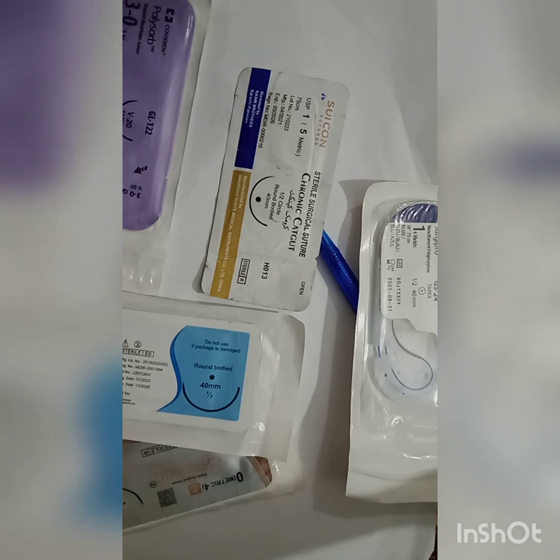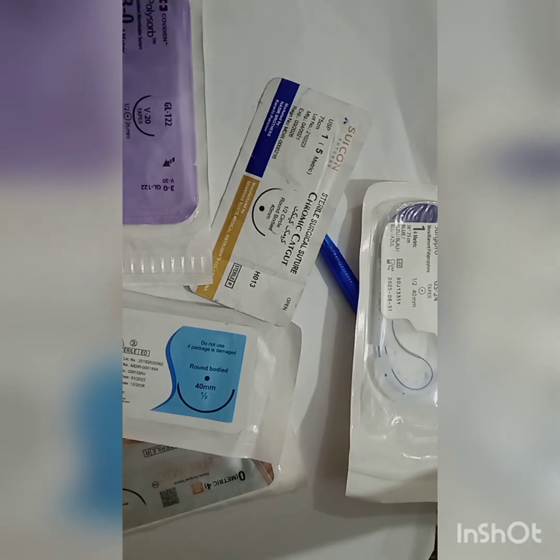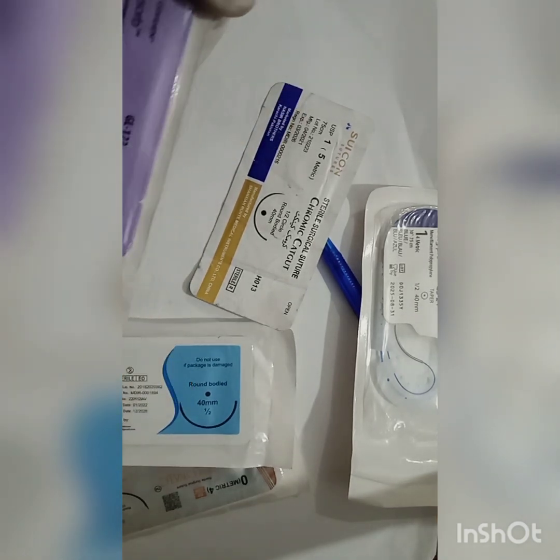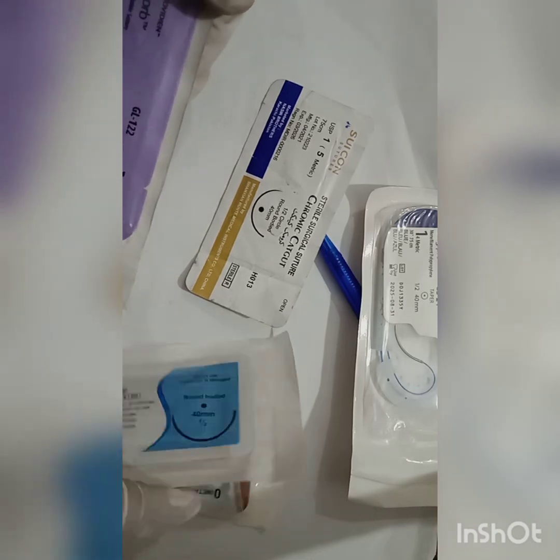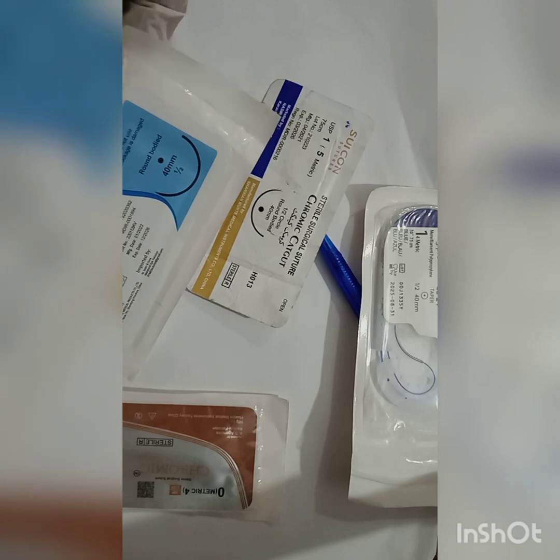The one thing important to note here is that different suture materials have different degrees of stability of the knot. The braided sutures like vicryl and silk have stable knots as compared to non-braided or monofilament ones like prolene or catgut. Okay, so then we come to the other points.